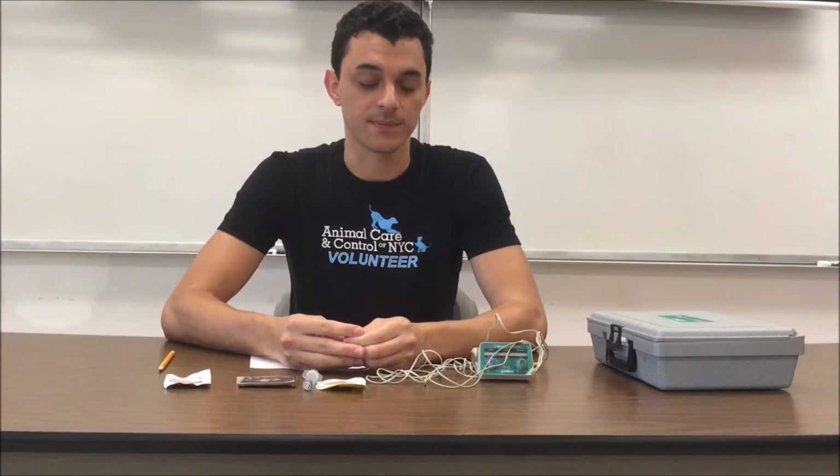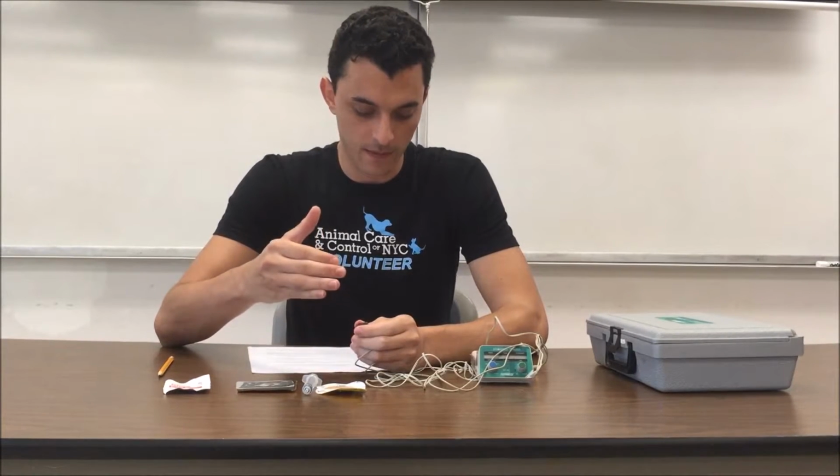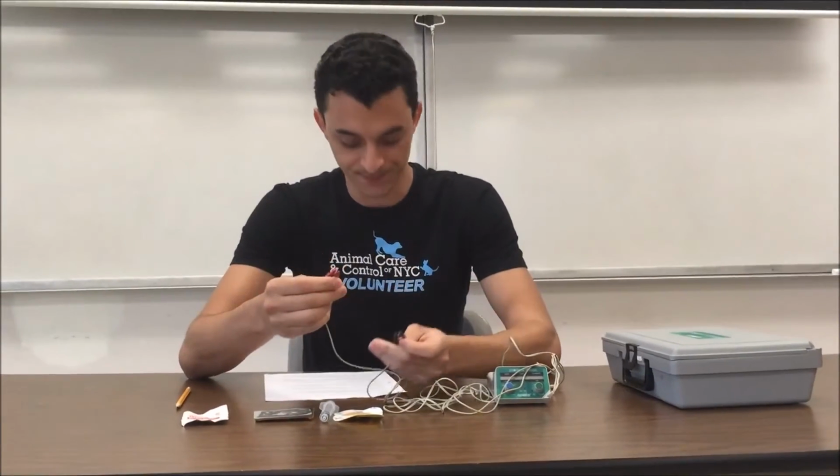I'm going to be demonstrating the use of this iontophoresis machine for therapeutic rehabilitation. Now the basic purpose of iontophoresis is to deliver medications transdermally, or through the skin, especially if someone can't tolerate oral medications or medications via injection. So medications are electrically charged, and depending on whether they're positive or negative, they can be repelled or essentially pushed through the skin via these electrodes here.